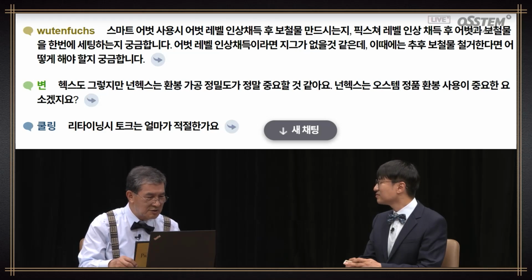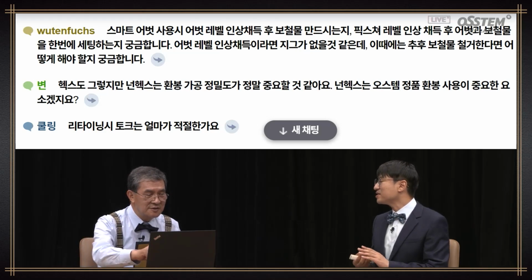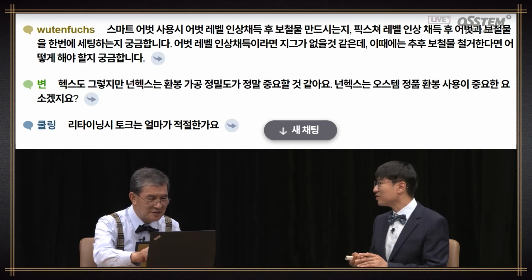In removing the prosthesis, how do you do it? I think the downside of my way is related to removing cement. That's why I don't take it out. If necessary, I take an implant level impression and then make a jig once again. Okay.